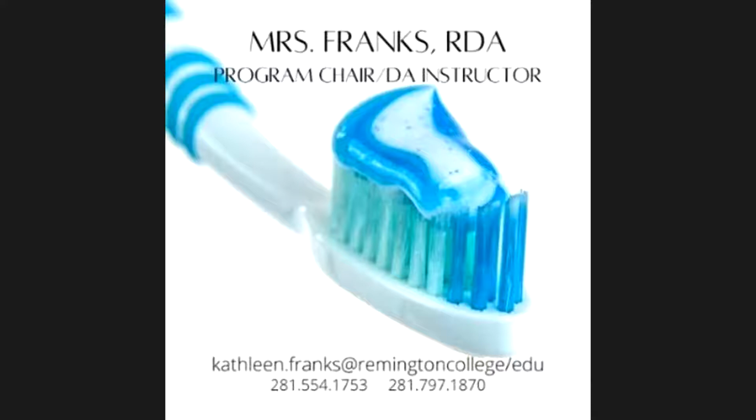You need to retract their cheek, right? You need to look at where you're placing the x-ray; it is so important. I've been taking x-rays for 40 years, and every time you get a little bit better at it.